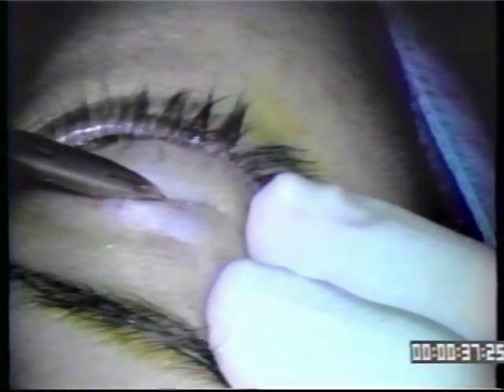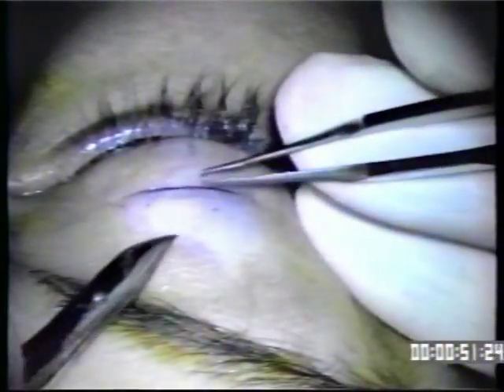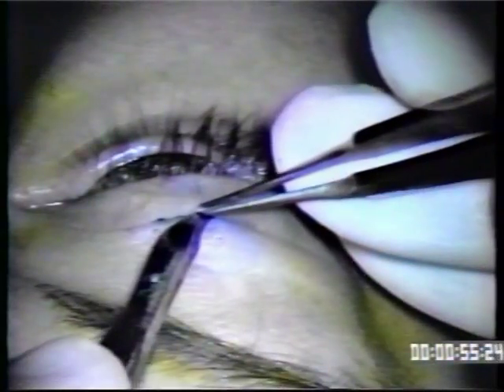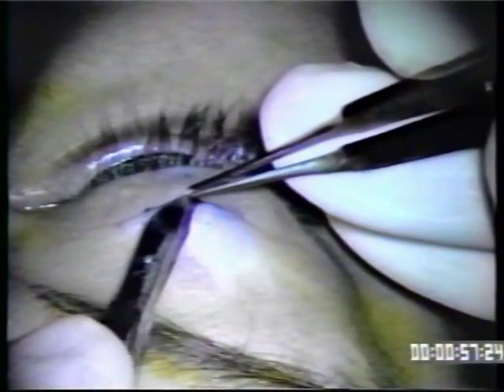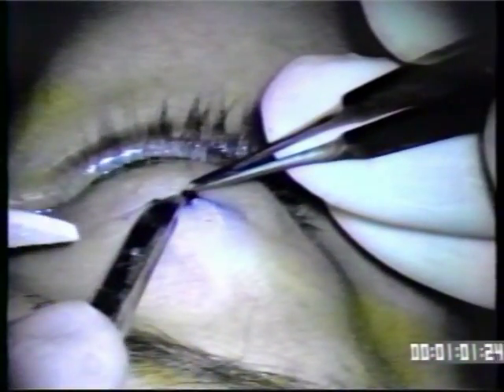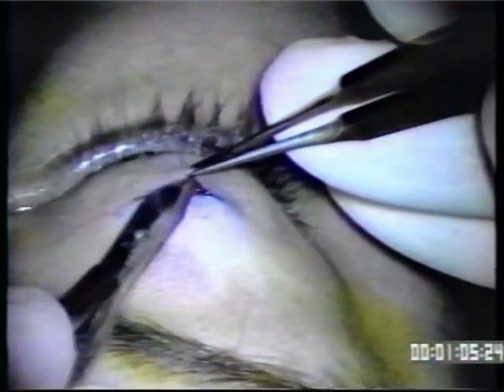The razor blade knife is useful because it's a sharp instrument. It easily cuts through the skin and the depth is controlled — down to subcutaneous tissue but not through muscle. We do this under local anesthesia because we want to be sure that the gold establishes good eyelid closure, even though we test them in the office before we put them in. It's always good to double check in the OR situation.